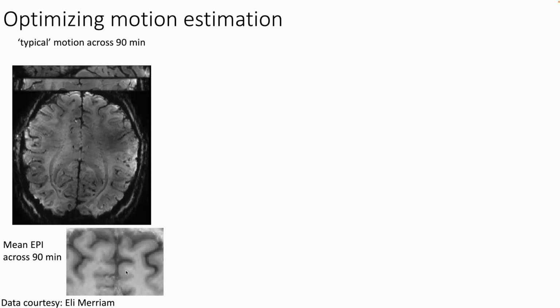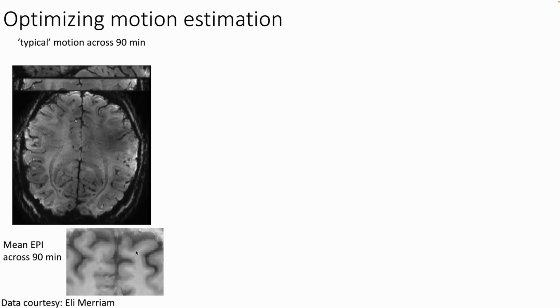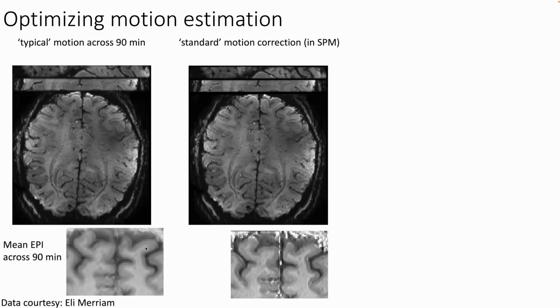Yes, it's blurry, but across the entire time series, a voxel that might be kind of up there still has a higher probability of capturing superficial layers more often than the deeper layers. And a voxel kind of down there has a higher probability of capturing signal that's close to the white matter, right? Because it's close to this border. And we still see this border. If I pump this through a conventional motion correction pipeline and average all the time series, it looks much crisper, so we don't have this blurring due to motion.